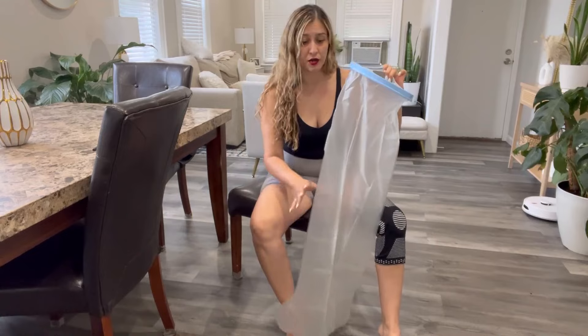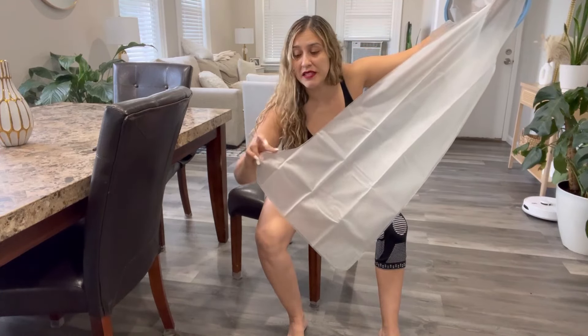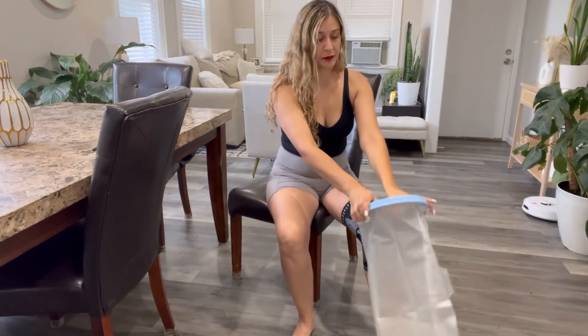To put it on, as you can see at the bottom, it has a protrusion in the front. This is basically where your foot will go — the tip of your foot. So this is the front of this leg protector.